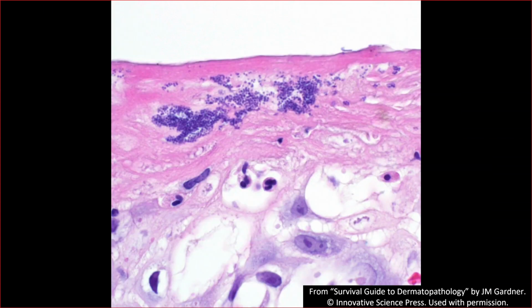And there's the nice cocci bacteria here. And look, this is not a gram stain. This is an H&E. You can tell because of the purple color of the normal keratinocyte nuclei. Look how tiny bacteria are. That's a neutrophil there. The bacteria are so tiny. One way to tell bacteria from debris is they're all the same size. They're all perfectly little round tiny dots. This again is a super zoomed in view. It's very difficult to get good pictures because bacteria are so small.